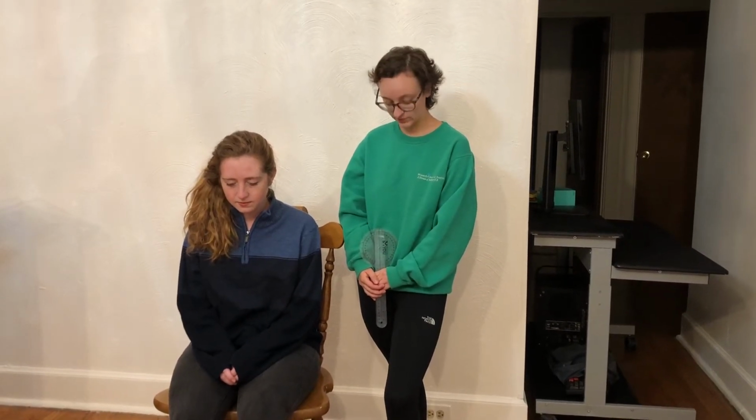For this occupational therapy portfolio topic, I'm going to be running through goniometry. So first I want to note the difference between active range of motion and passive range of motion. Active range of motion is your client actually performing the action by themselves, whereas passive is you doing the motion for them.